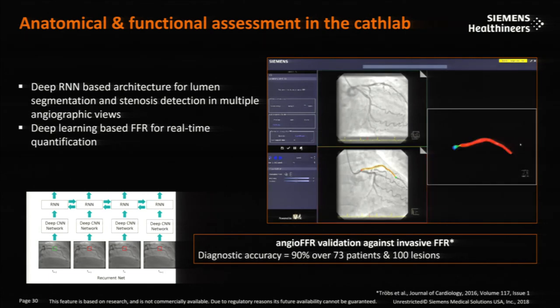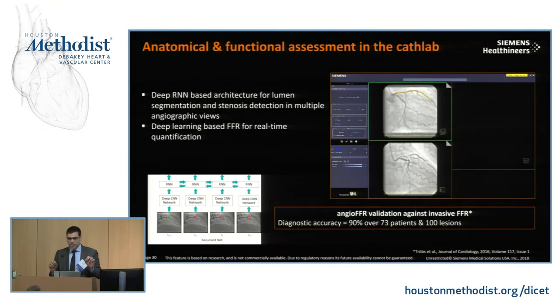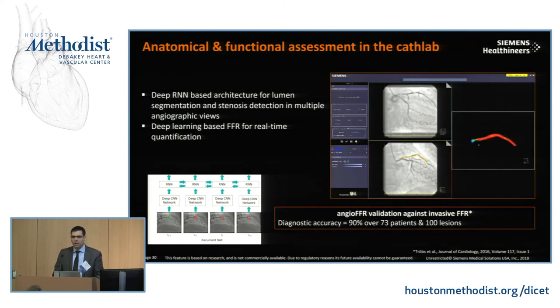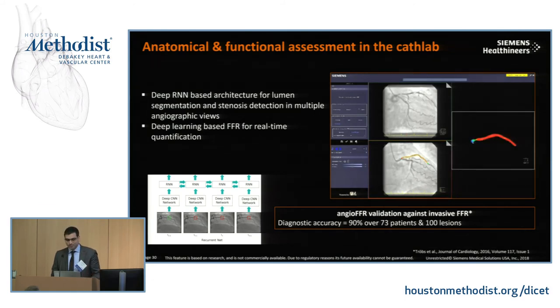So basically, what you do is that you click two points of the coronary of interest. Machine learning automatically segments the coronary, identifies the stenosis, and then you get a real-time FFR that is calculated using deep learning. And this FFR value actually matches very, very well. We have a correlation of 0.99 with the computational fluid dynamics value, and we are now doing comparison against invasive FFR to see the validity of the technology. So now you can think of not sending any wire anymore and being able to do non-invasive FFR just at the bedside.